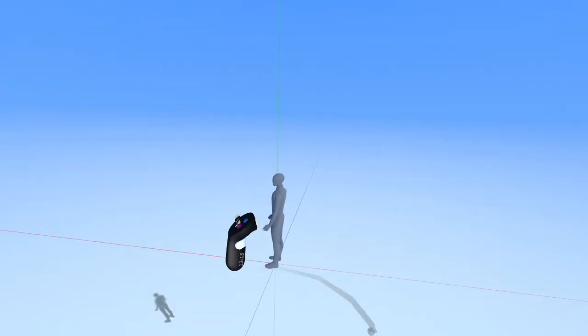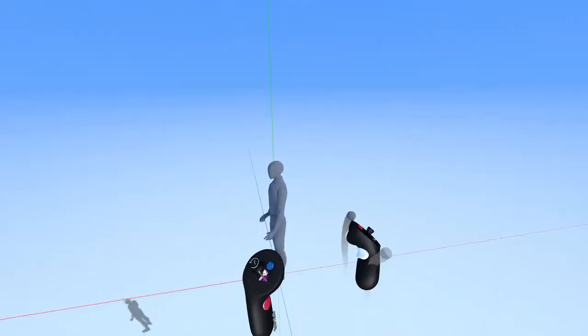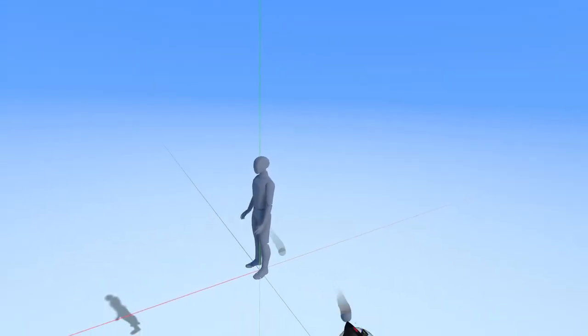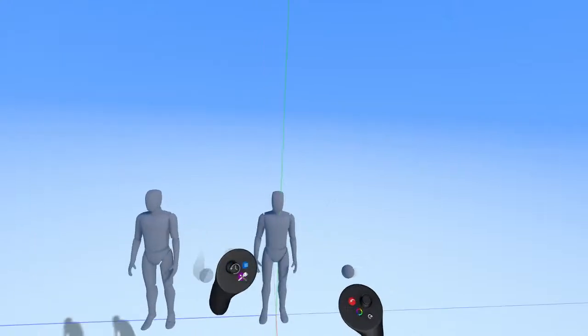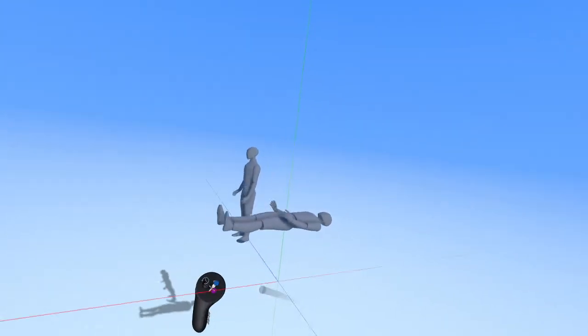Okay, great. So this is a good mannequin to have because it's facing upwards, and so that could stand in as a representation for the doctor or one of the surgical nurses. So let's move that off to the side, and let's actually duplicate another one here. And what I want to do is rotate this guy so that it's representing the patient here.